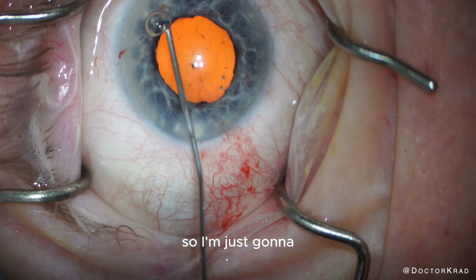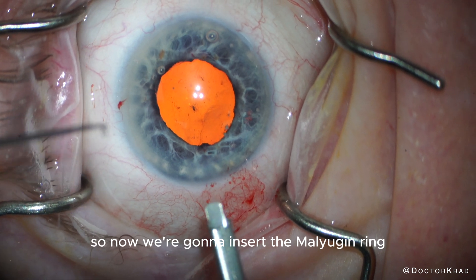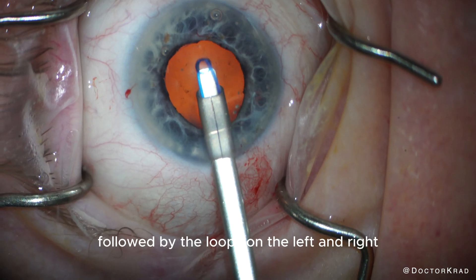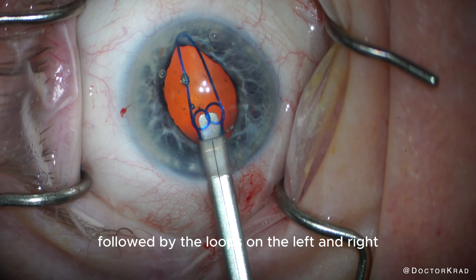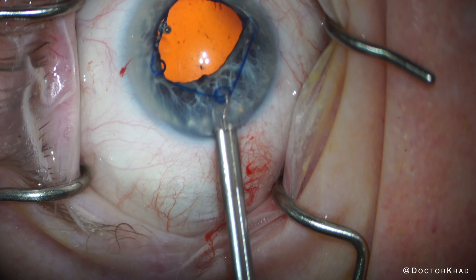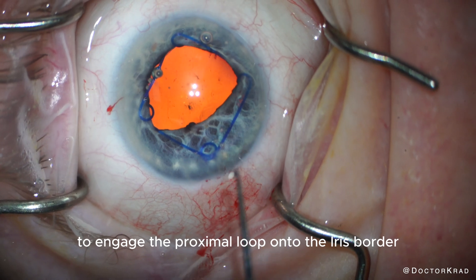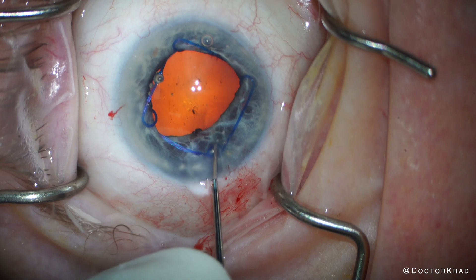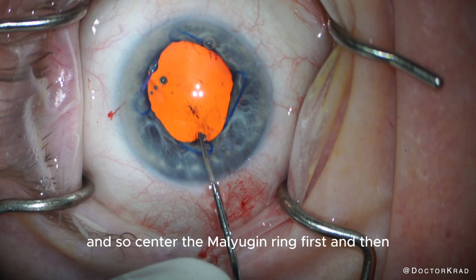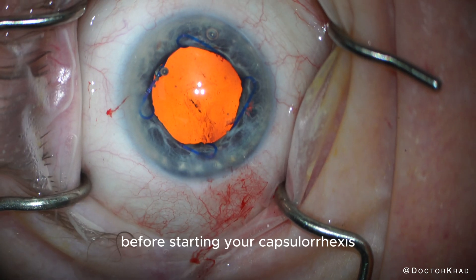This air bubble is annoying me, so I'm just going to remove it with a cannula prior to putting in the ring. Now we're going to insert the Malyugin ring — I'm going to engage the distal loop first, followed by the loops on the left and right. It's nice when you get them all together, but you can always insert them one by one. Next, we'll use the Malyugin manipulator to engage the proximal loop onto the iris border. And so, center the Malyugin ring first, and then inflate the AC with a little more viscoelastic before starting your capsulorhexis.